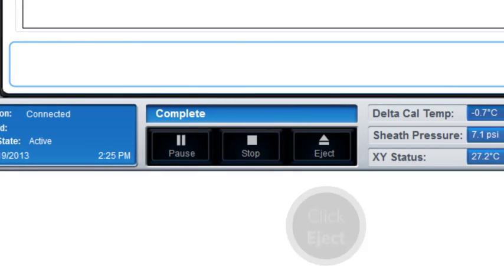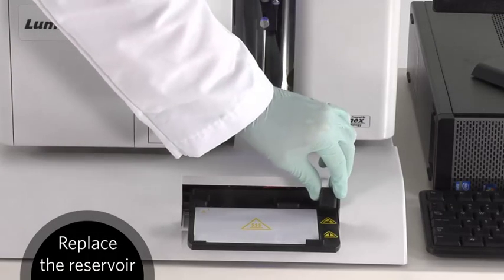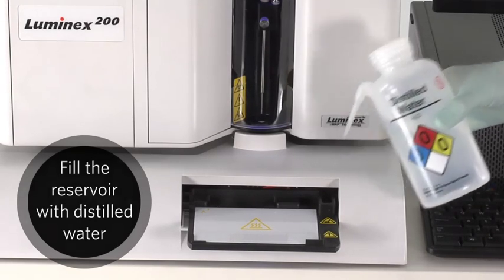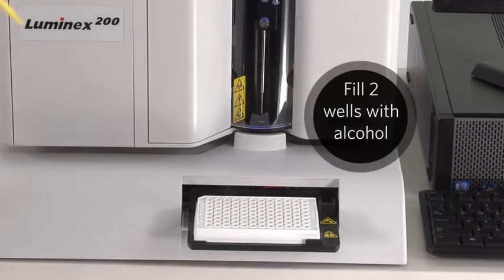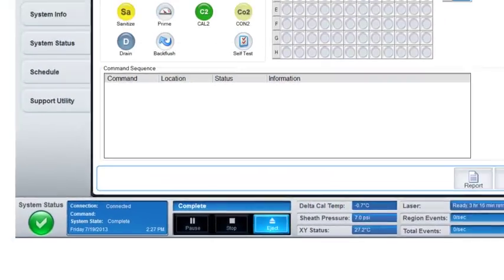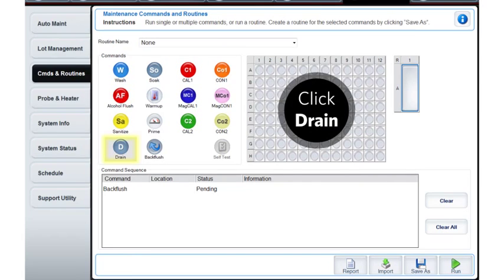Eject the plate holder. Empty out the remaining bleach from the reservoir. Replace the reservoir and fill it with distilled water. Place one of the 96-well plates that the probe is adjusted to on the plate holder. Fill any two of the wells completely with alcohol. Retract the plate holder. In the routine section, click on the Back Flush command, then the Drain command, the Back Flush command again, the Drain command, the Back Flush command, then the Drain command one more time.